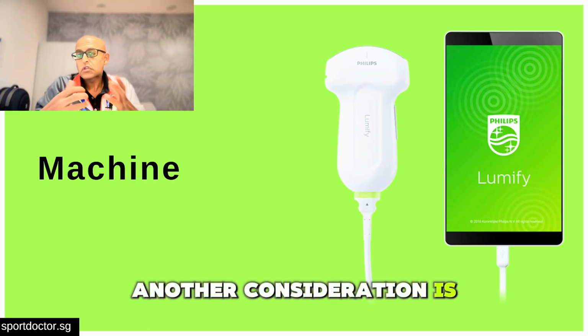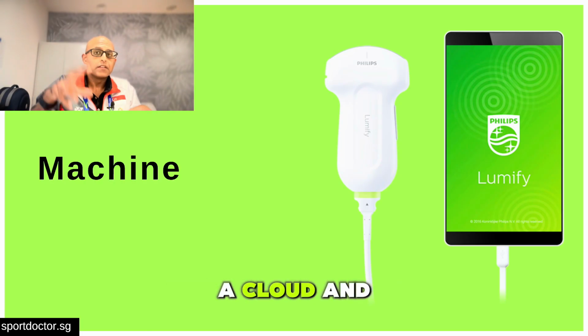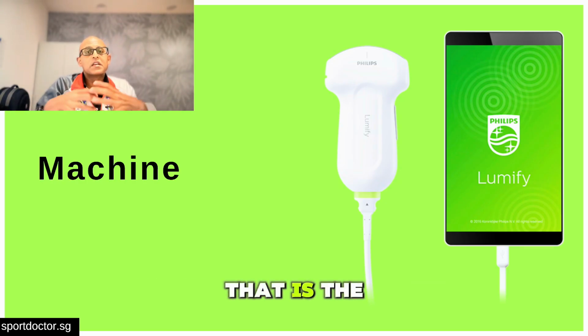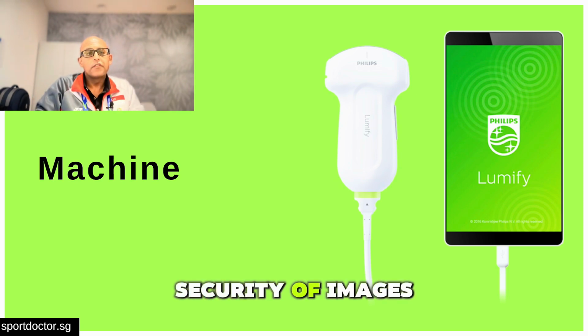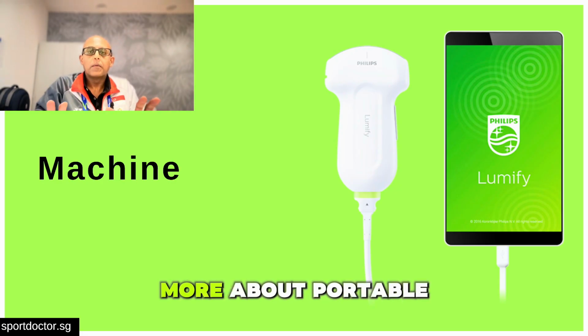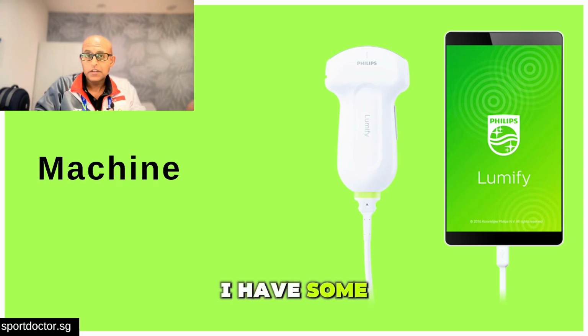Another consideration is storage of the images, whether it's stored locally or on a cloud. And so, again, another consideration after that is the safety and the security of images and patient data. If you do want to know more about portable tablet-based systems, I have some videos on my YouTube channel which you can refer back to.